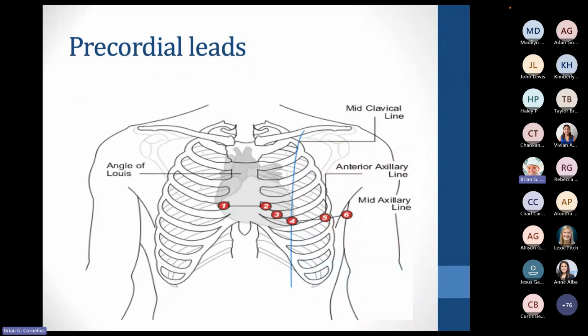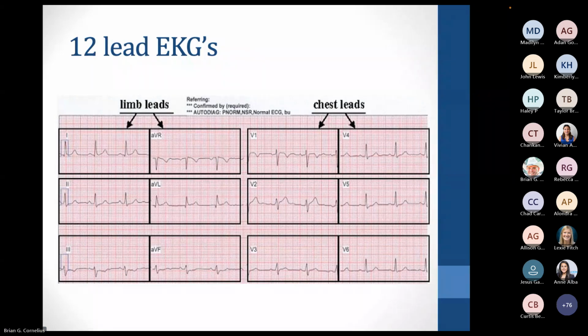Think about your placement for your different EKG electrodes as you're looking at a 12 lead and kind of how those apply, so you're familiar with those locations. Be mindful of the difference between limb leads and precordial leads as far as views, and think about, for different arrhythmias, kind of what may be a more beneficial lead to evaluate. A lot of times we use lead 2 for continuous monitoring. V1 or V2 may be beneficial, or even V5, depending on what's going on with your patient.